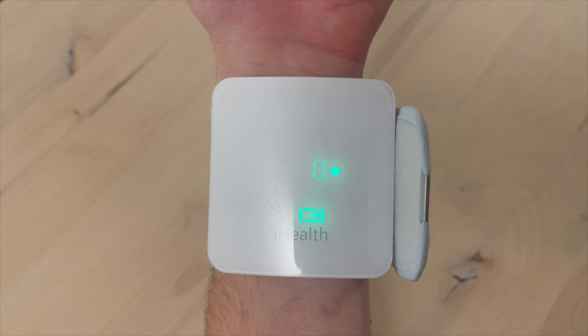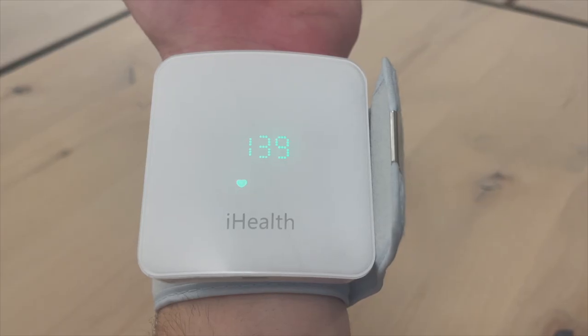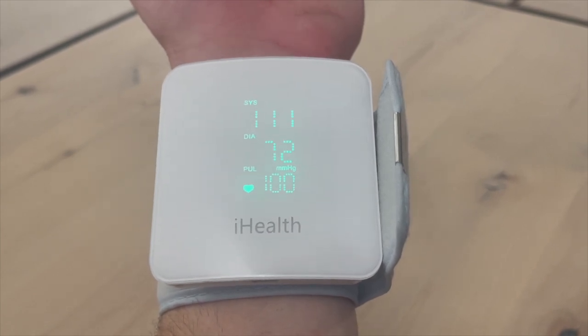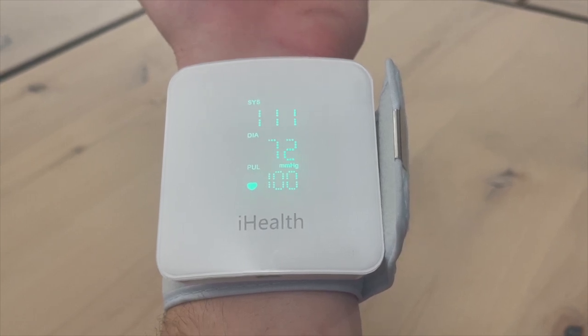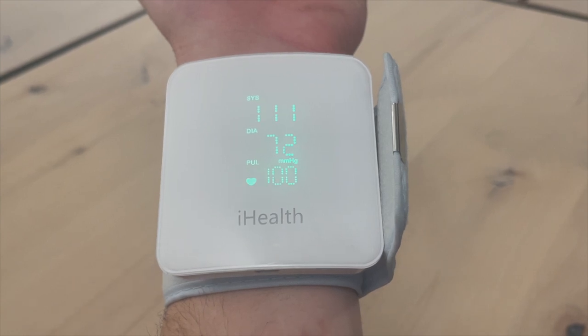But once the device is level with your heart, a solid dot will be displayed, and you can then take a measurement by pressing the start-stop button one more time. When the start button is pressed, when you are correctly positioned, the cuff will slowly inflate and then deflate to take your blood pressure reading. Once your reading is complete, the blood pressure monitor will display your results.